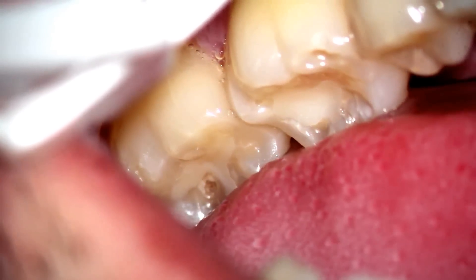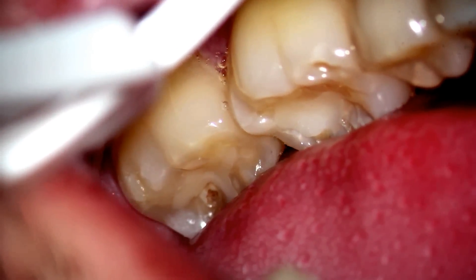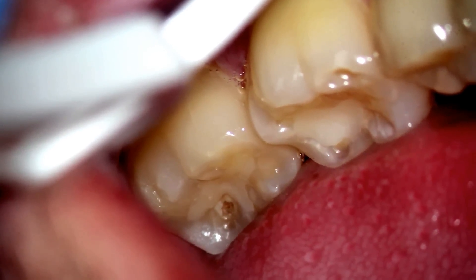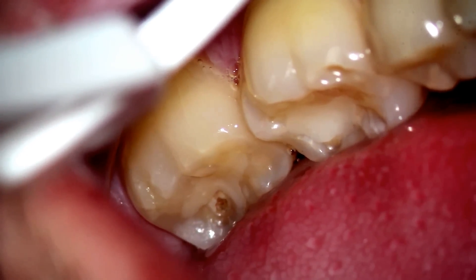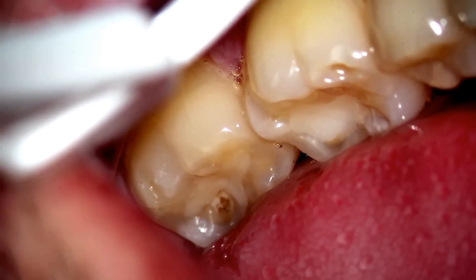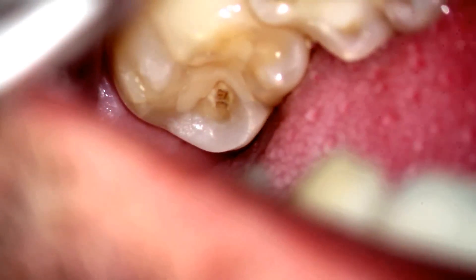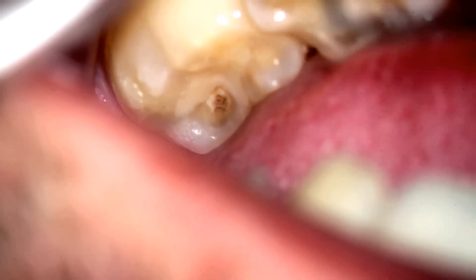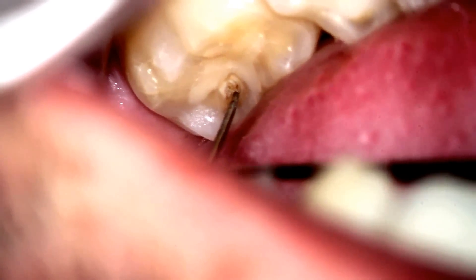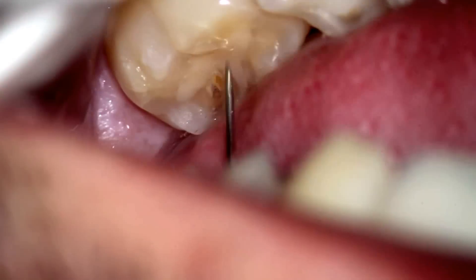As we look at the actual exam, you can see a hole in the filling where the patient has ground down the tooth on the second molar. You can also see some erosion where the enamel is worn away on the cusp tips of the first and second molar. As we get closer, you can see the wear that's occurred and possible chipping of the tooth. So there are multiple problems that have caused this particular restoration to fail.